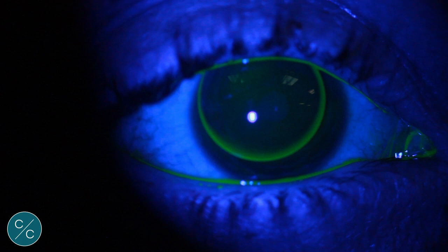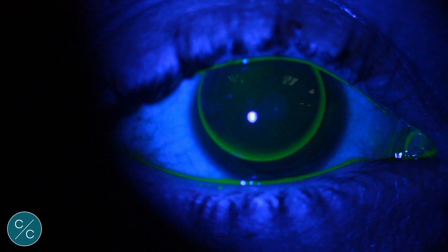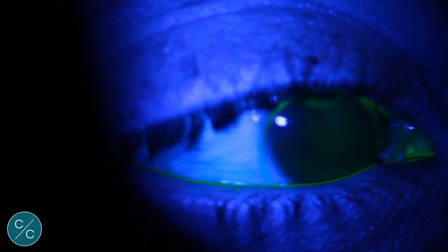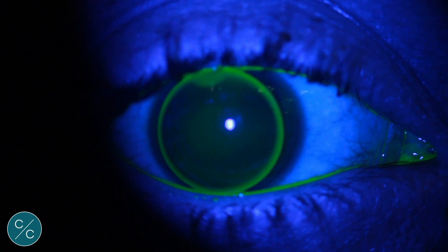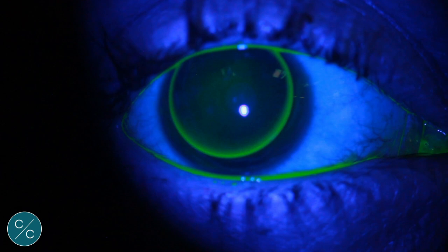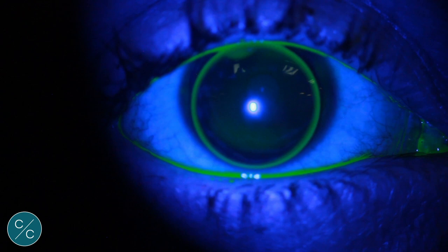Let's look at this 7.95 on the eye. Immediately the picture looks better — we've got a nice band of clearance around the edge of the lens. The lens is moving across the apex nice and slowly with the blink. At last I think we can safely say that this lens is going to be more comfortable than the others and is going to centre better. So this will be our final lens, this 7.95. I hope these few clips have been useful — they certainly taught us not to rely solely on software. Knowledge of fluorescence patterns and, more importantly in my case, movement of the lens are key components of a successful fit.